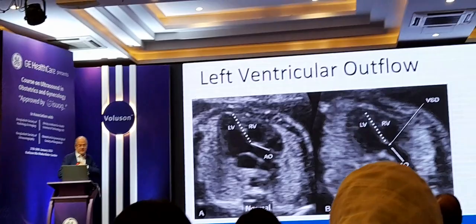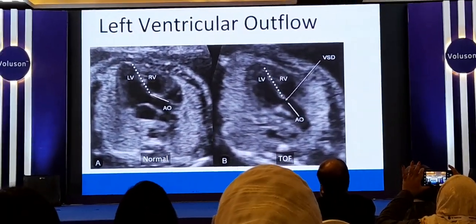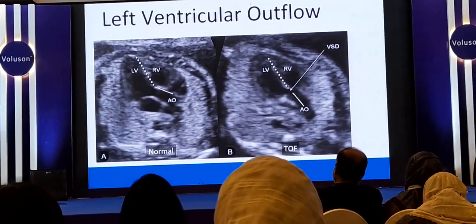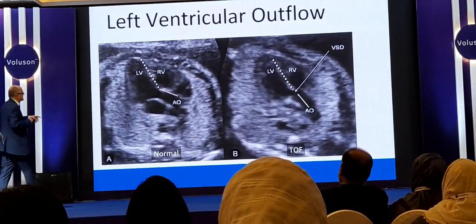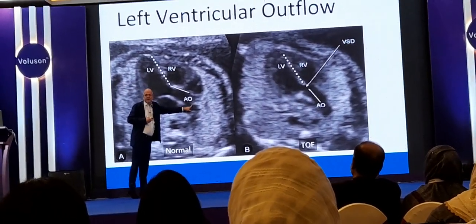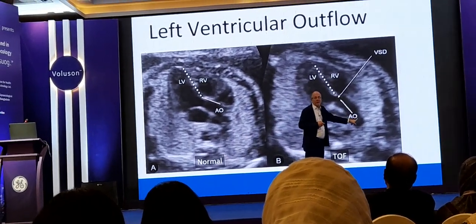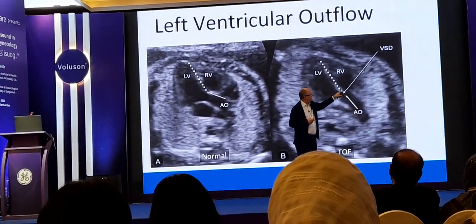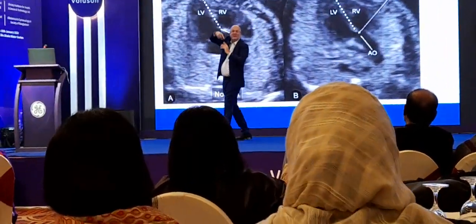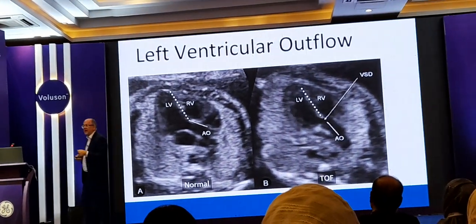Can you see why that curve is important? What's going on the right-hand side there? It's straight here. What is this vessel? Angle. Left ventricle. What is this vessel? Aorta. What is this aorta doing? Overriding. It's an overriding aorta. Why? Because there's a little defect there, the VSD that's pointed out in the arrow.